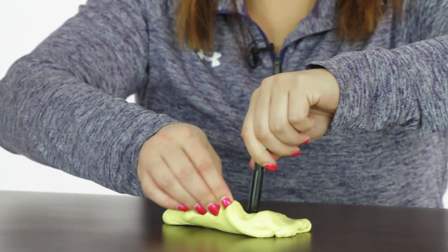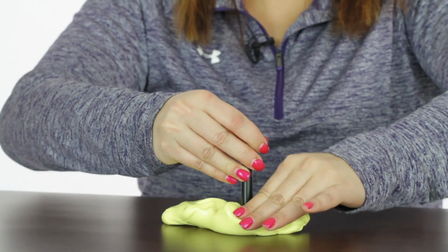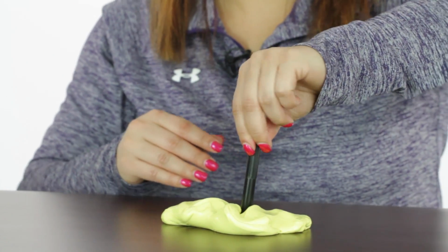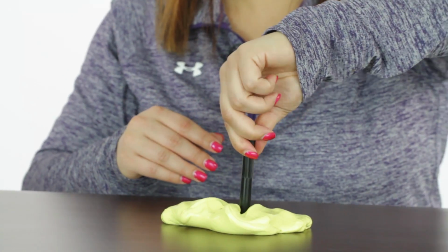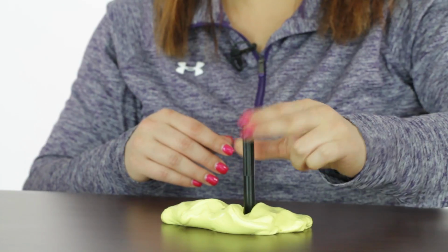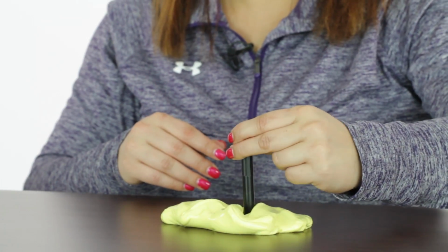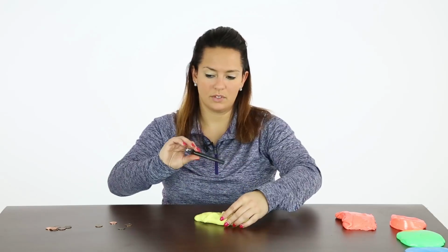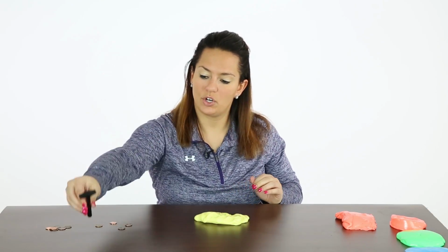I'm going to hide it again, the face, so I don't see the T anymore. And just practice turning. It doesn't have to be big turns, it can be small turns at first if this is difficult. And I'm using kind of my three pincher grasp fingers here. So that's the putty size peg turn.